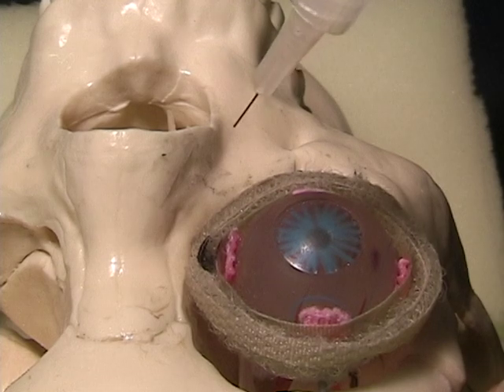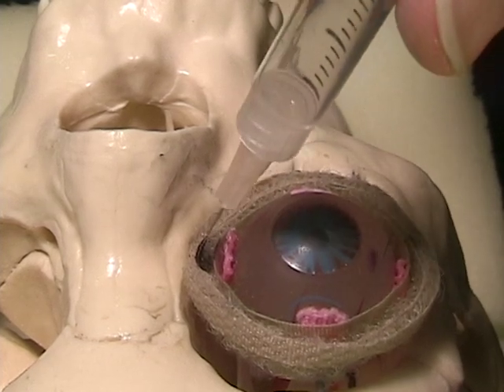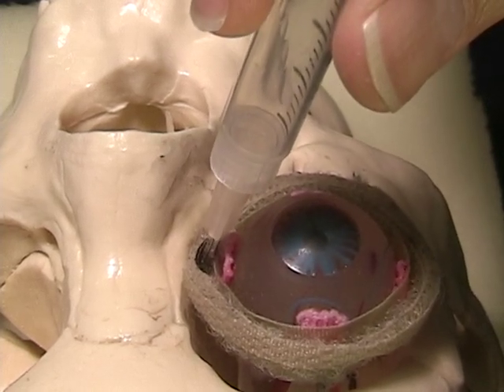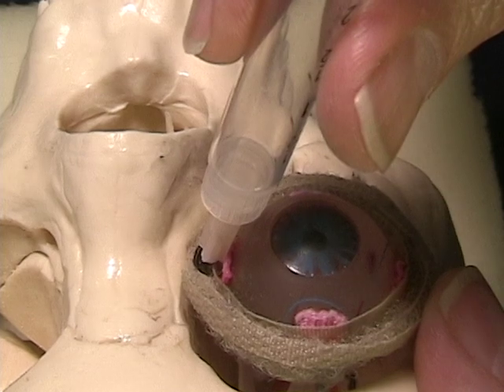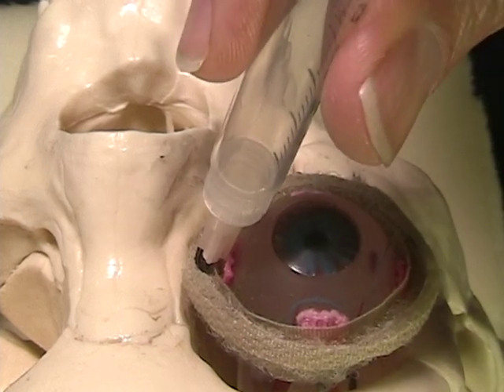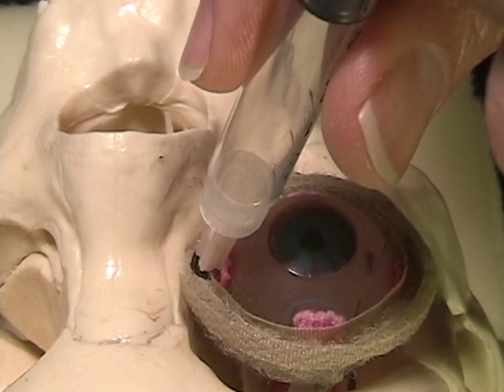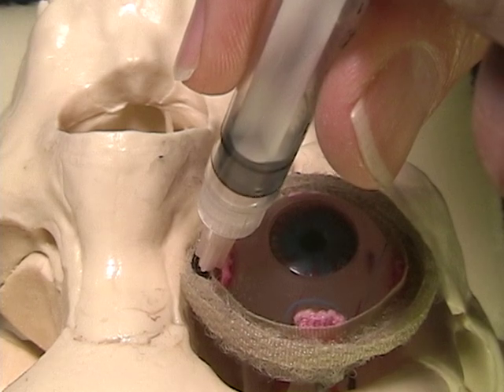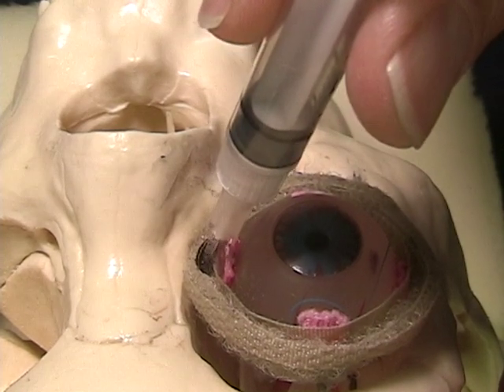Next we'll see the medial caruncle extraconal injection. We'll identify the landmark of the medial caruncle and, at about a 60-degree angle with the bevel towards the globe, insert a 30-gauge one-half inch needle to the hub of the caruncle. We can then aspirate and inject 3 milliliters of local anesthetic. As we complete this injection, we will withdraw the needle at the same 60-degree angle so the tip of the needle does not face the globe.